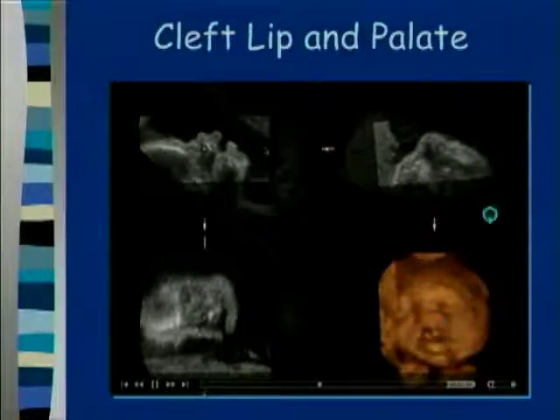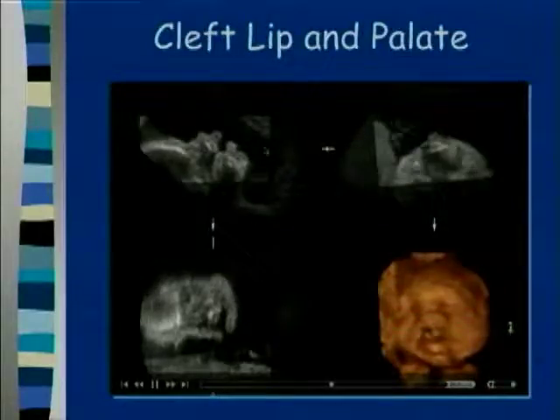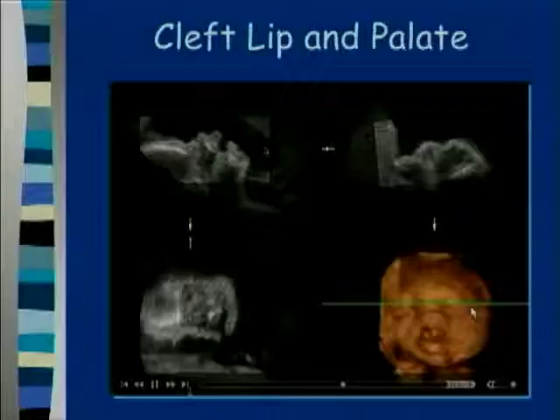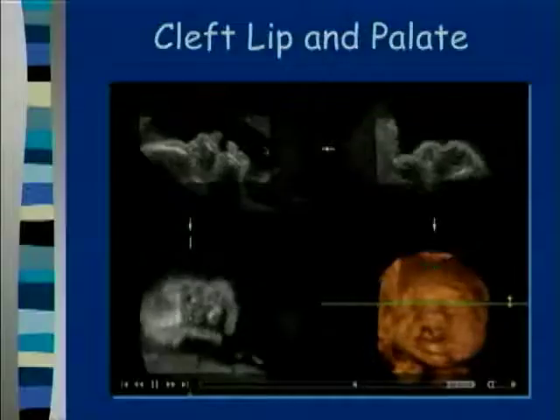And then we take the image, and now our goal is to try to make this face symmetrical, and we usually use the orbits to help us decide. So in the upper right-hand corner, you can see the 2 orbits. So we're going to try to rotate that face, so the orbits are flat as well. There we go, almost there.